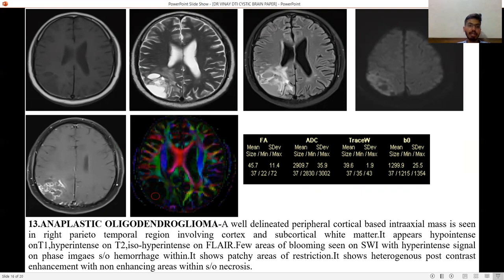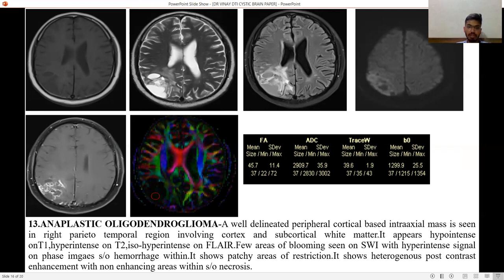Anaplastic oligodendroglioma — a well-delineated peripherally cortical-based intra-axial mass seen in the right parieto-temporal region, involving cortex and subcortical white matter. It appears hypointense on T1, hyperintense on T2, iso to hyperintense on FLAIR, with few areas of blooming on SWI suggestive of hemorrhage. It shows patchy areas of restriction and post-contrast heterogeneous enhancement with non-enhancing areas suggestive of necrosis.